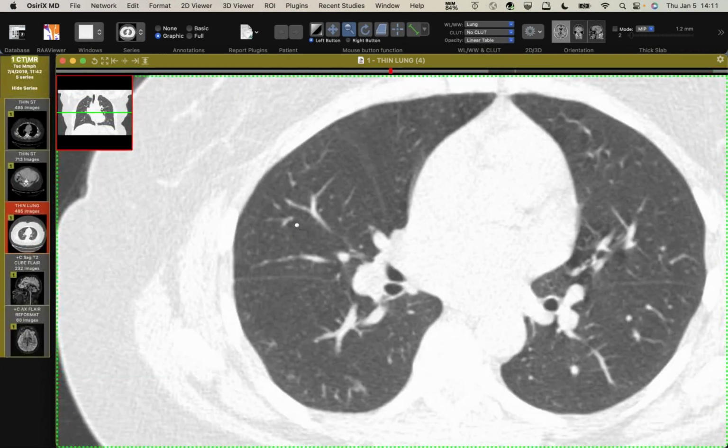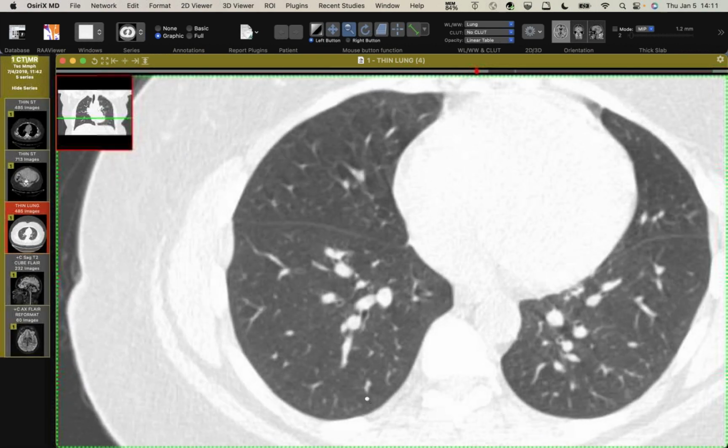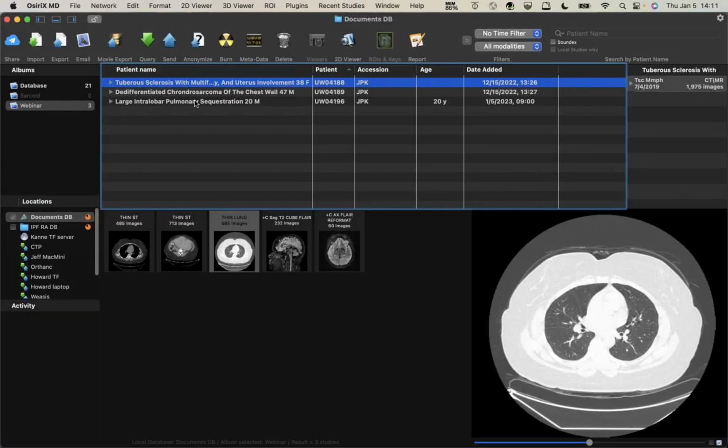So this is something we don't see much. I've never seen it with sporadic LAM. I've seen it with tuberous sclerosis, but this is presumably the pneumocyte hyperplasia. But I've not seen uterine masses in patients with tuberous sclerosis before. Let's see if I remember what I wrote down. I just wrote uterus. Yeah, so multifocal micronodular pneumocyte hyperplasia. So that can be a finding of TSC. I don't usually see it because I don't look below the liver. Yeah, we don't either. I'm joking. That's how she showed up, with this pelvic mass.